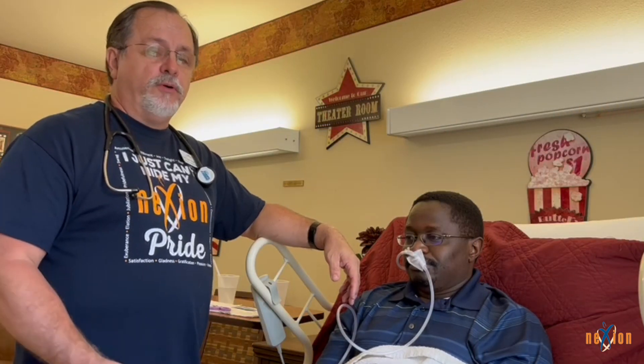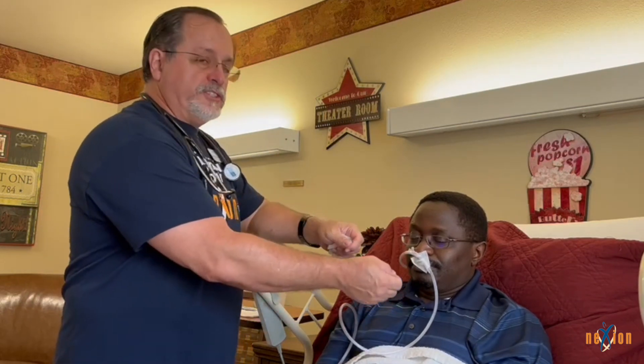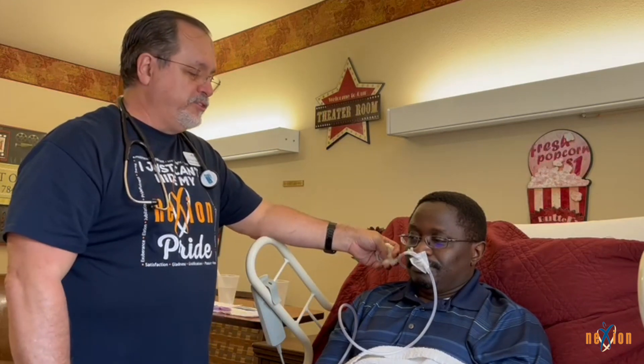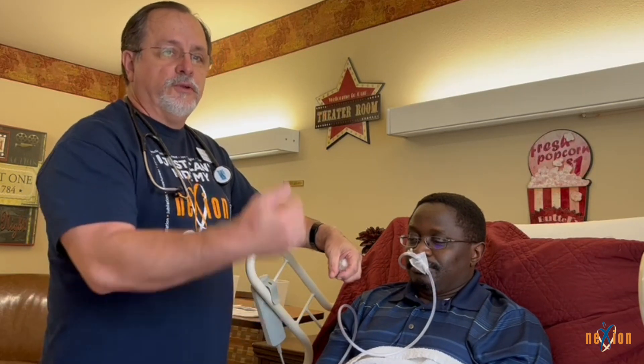One important thing: at any point, if you check placement and see the NG tube has come out some, or you inject air and do not get an exchange, do not start the bolus feed or flush. If the NG tube has come out, you need to reinsert it. If it has only been pulled out a little bit, you can reinsert it back into the nasogastric position. Always check for placement again before putting anything into the NG tube.